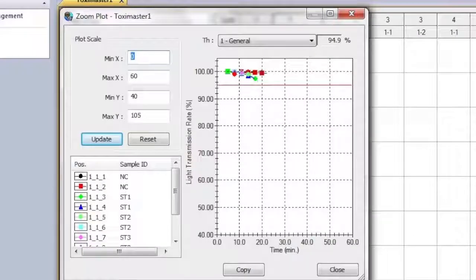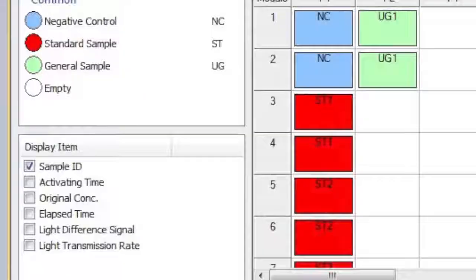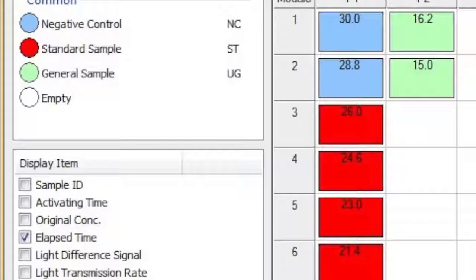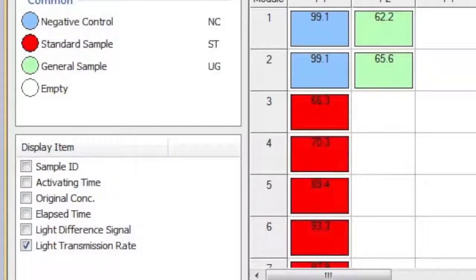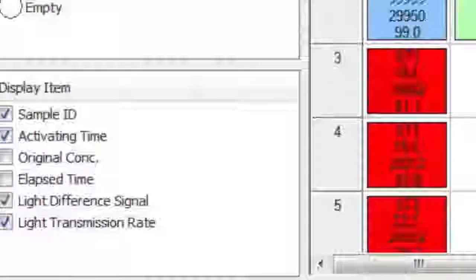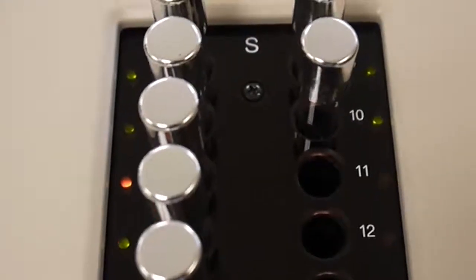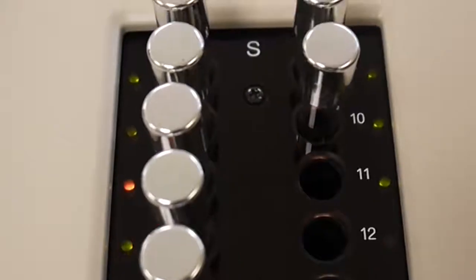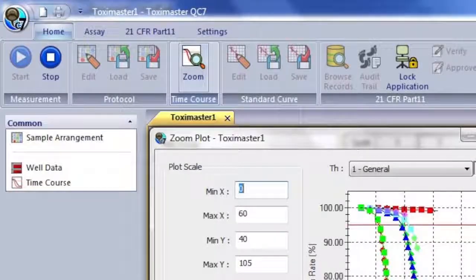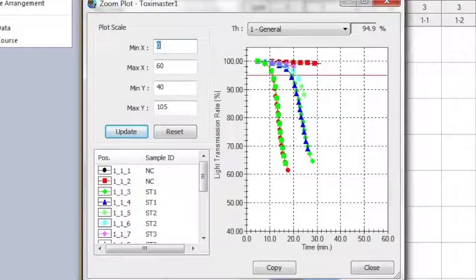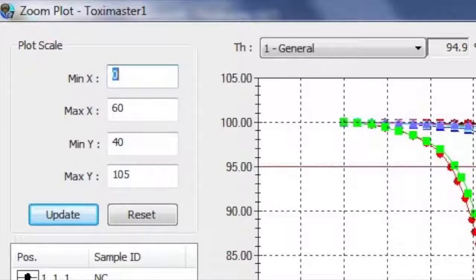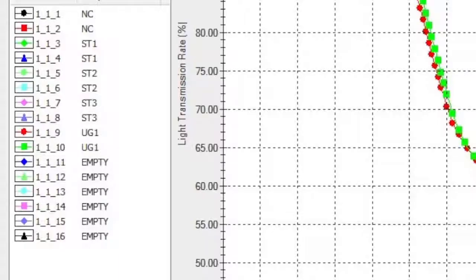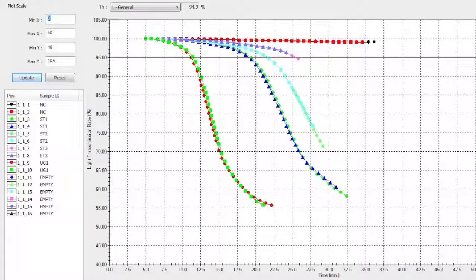Notice within the Display Item box the various information that can be displayed for each sample. As we return to our zoom plot throughout our testing cycle, we will note some additional features. You can adjust the data seen in the Zoom Plot box by changing the numbers within the plot scale. Each sample is represented by a color and shape within the zoom plot. The zoom plot can also maximize to full screen.